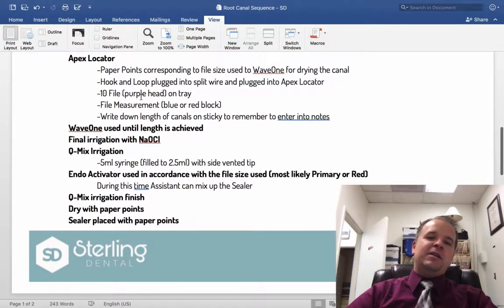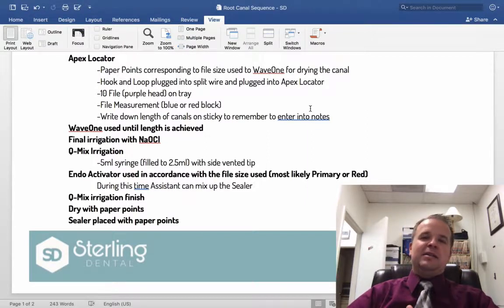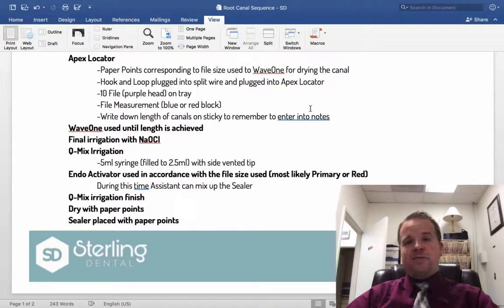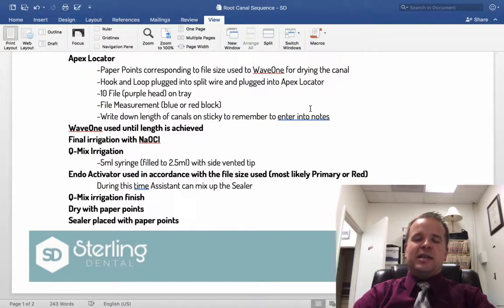I have down here that you'll write it down, and then that way you don't forget it. And I think that's a great idea, because then sometimes you'll get to the end of the procedure, which is an hour, hour and a half long, and an hour later you're like, oh, what was that canal length? And especially if they get complicated in 3 or 4 canals, that's where it gets kind of tricky.